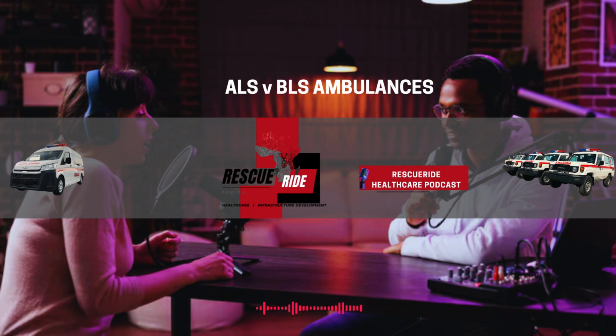So BLS ambulances carry a variety of devices like cervical collars to stabilize the neck, splints for broken bones, and head immobilizers to prevent further head or spinal injury. And I'm guessing those come in different sizes for adults and children, too. You got it. It's all about providing the right support for every patient. So it's like a mobile ER. Yeah. Minimizing movement to prevent any more damage. I'm really starting to understand how vital this equipment is.